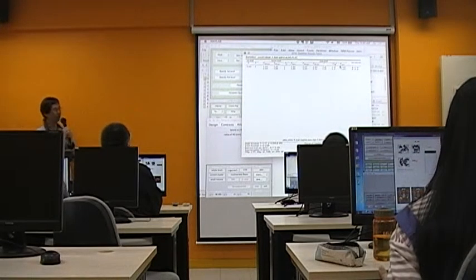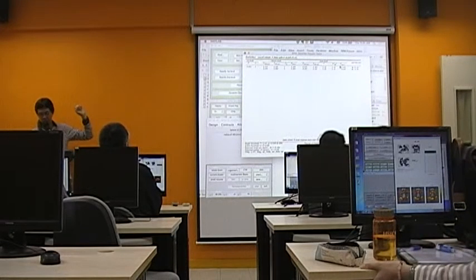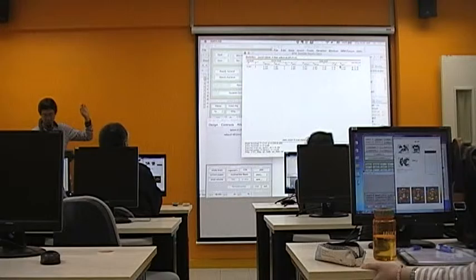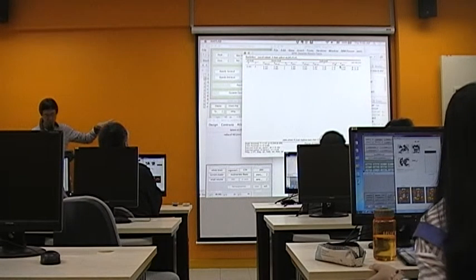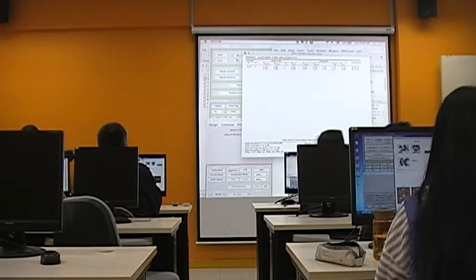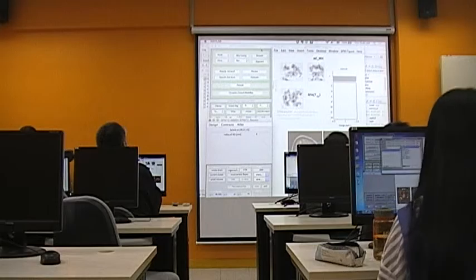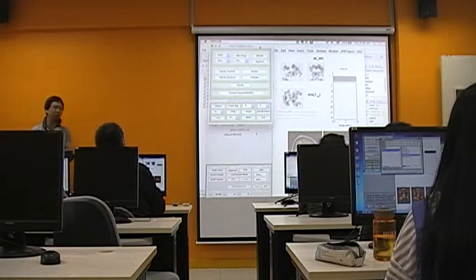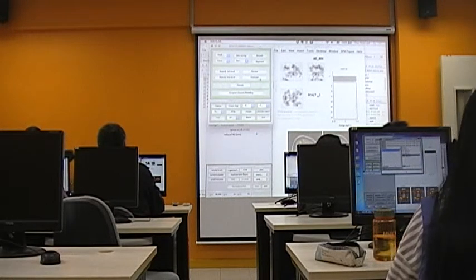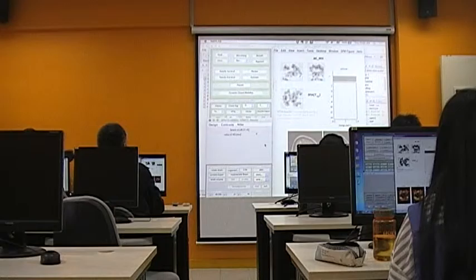Okay, so this is combining a one sample t-test with data exploration or data interpretation. We still haven't covered the two sample t-tests. Perhaps we don't need to do it because it's highly similar to the one sample t-test.